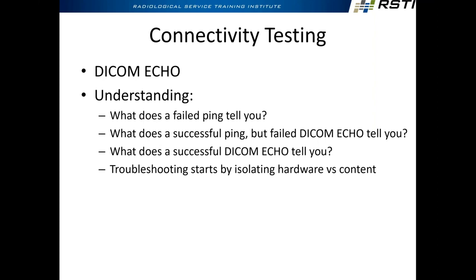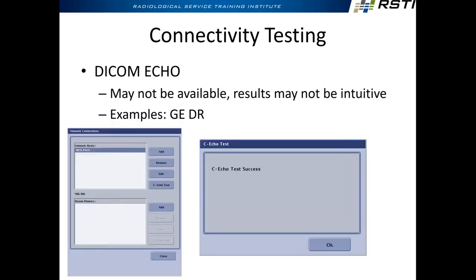Like we just saw there, that instance number was missing. In the DICOM tag, it said set instance to 0. That's because it can't be empty. 0 and null are two different things to a computer. Right? A null value is empty, and PACS says I have to have something, even 0 is something. So it told you, put 0 in there, give me something, so I accept it. Because null and 0 are not the same thing.